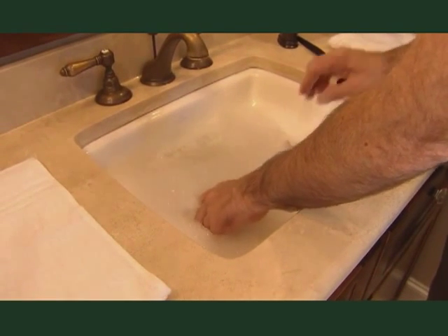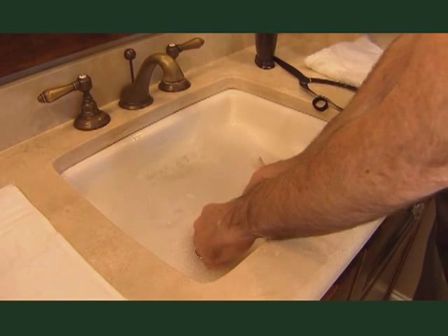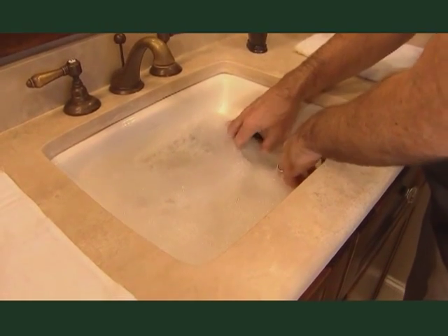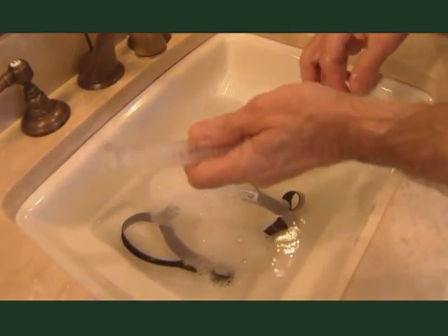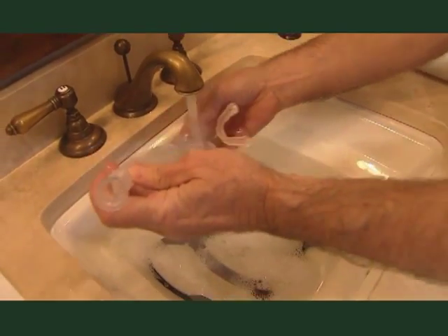Now on a weekly basis, fill your sink with lukewarm water that contains a mild, non-scented soap, such as Ivory liquid. Rinse all components, including the mouthpiece, nasal pillow seals, mask frame, headgear, and chin strap if used, for no longer than 10 minutes.